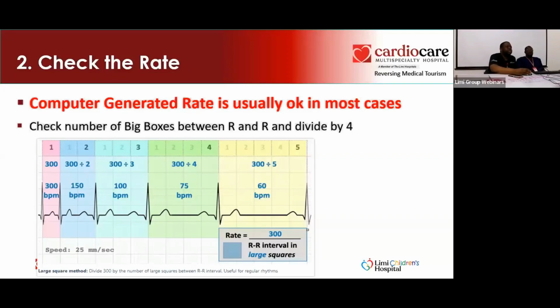Now, if you're a nurse, or anybody, and somebody is on admission, you have the ECG up, you should be able to see the rate of the heart. Anything that starts crossing 140, 150 is likely life-threatening. Don't say it's pain. If you are monitoring a patient or doing a surgery and you see that on your monitor, know that there's trouble. The next thing is you need to interpret that ECG so that you can take appropriate action. People don't just die. They normally give signs, okay?